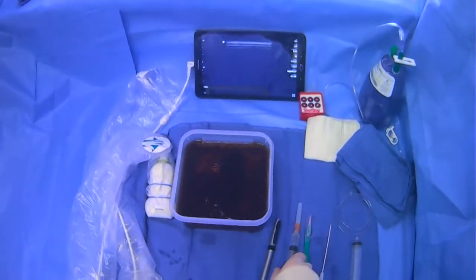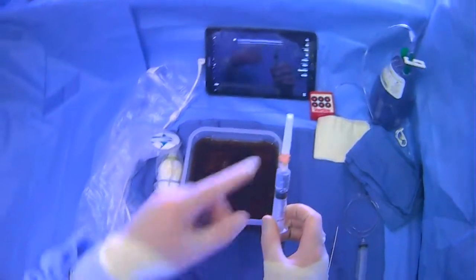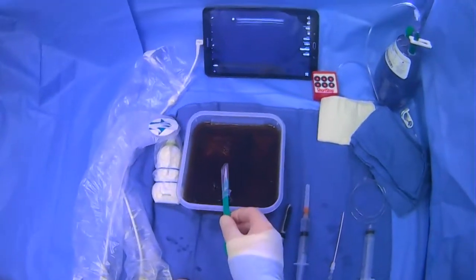You can prep the site. When it gets time to do the case, wherever you marked, you'll use your lidocaine. We have a 25-gauge needle here — make a skin wheal. After your skin wheal, you'll make your dermatotomy.